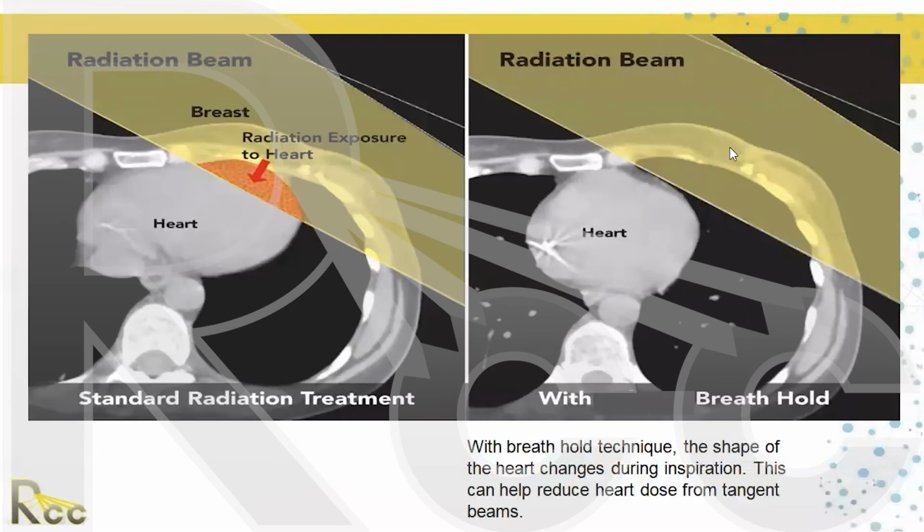We turn the beam on. Because it's a modern accelerator and delivers a very, very high dose rate, she only has to hold her breath for 20 seconds. 20 seconds, and the treatment's over. And by doing that, you treat the breast without treating the heart.